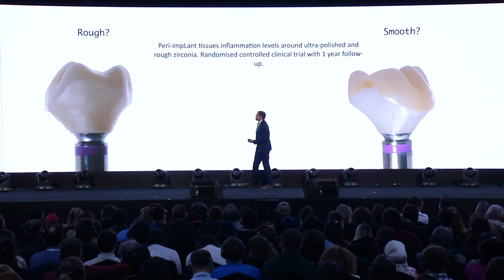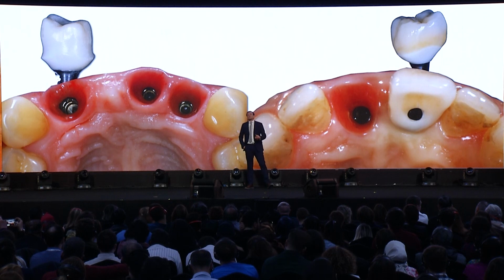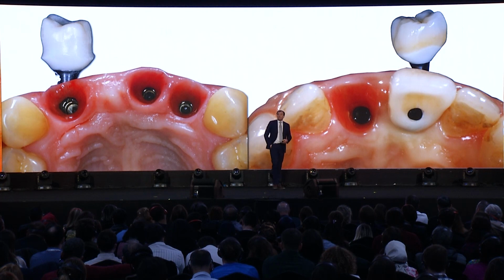I can say that again, we now have evidence really saying that super smooth zirconia, super polished zirconia to high gloss, gives you a better adaptation of the tissues and reduces the inflammation.